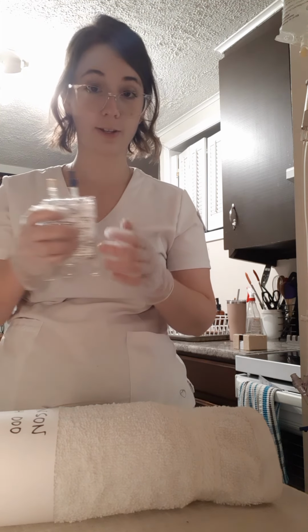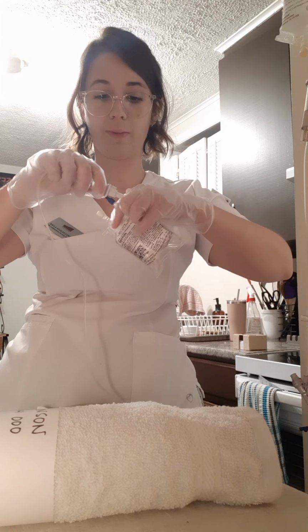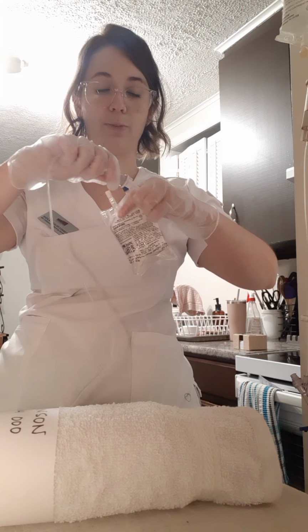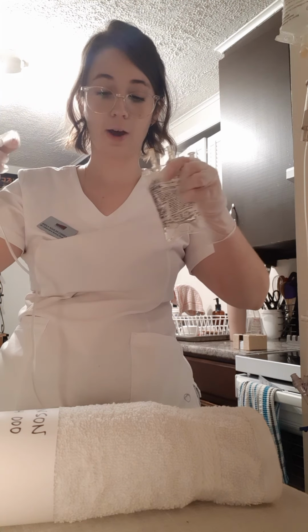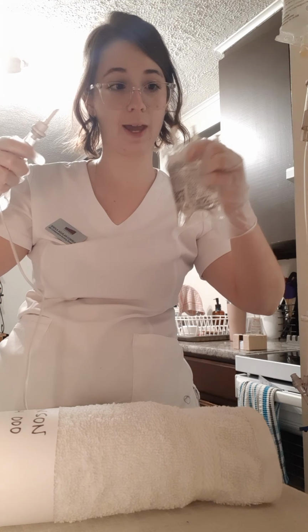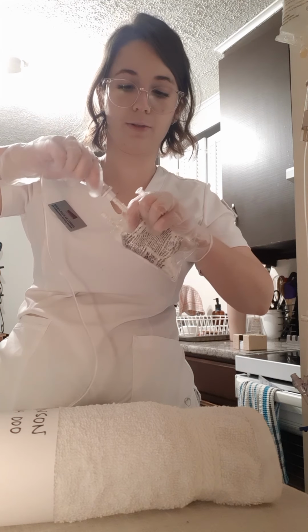Okay, so this is a sterile technique, so I have to make sure I keep sterility. So I'm going to remove my plastic cover and this. Now, I have used this many times, so ideally I would have it hanging, but I'm holding it in my hand because if not, it's going to drip everywhere. And I'm going to do this.